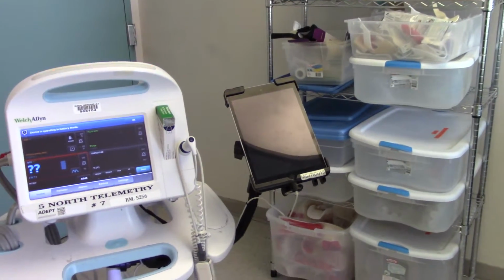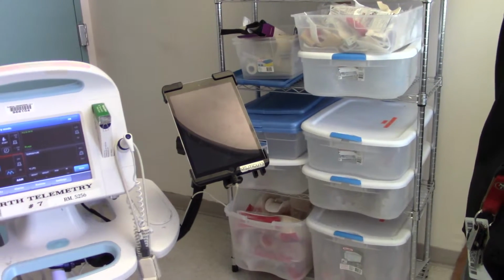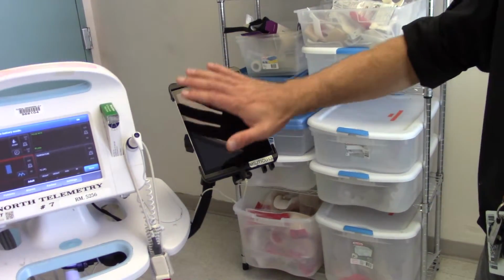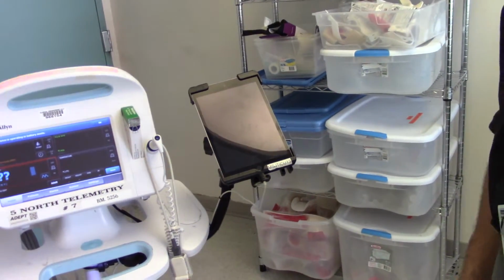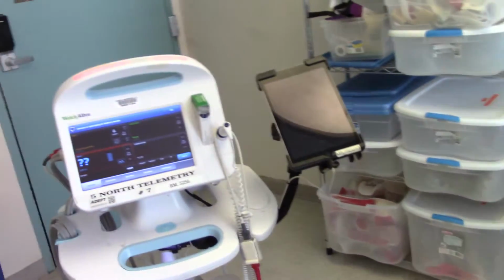All right. So is there anything else? So having a different arm that's not so vulnerable to breaking. Correct, yeah. More robust. It doesn't have the problem with the ball joints. And you're thinking just rigid, so it doesn't have joints. Right. So just something pre-shaped in the right position. No ball joints. They're not going to wear out. That's 99% of the way there, and that would save a lot.